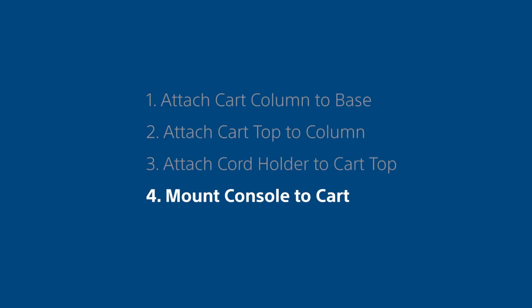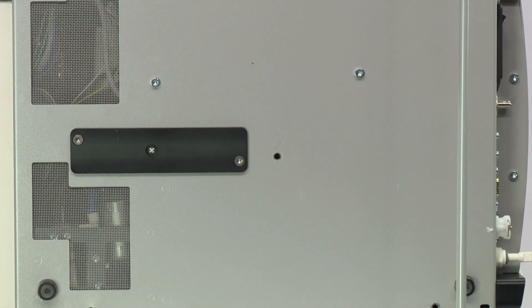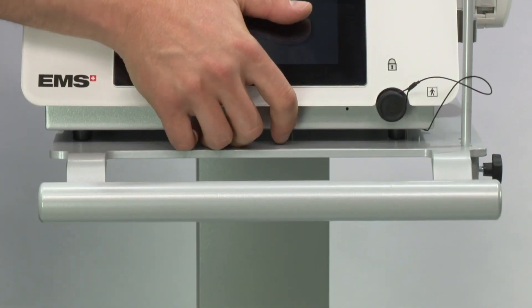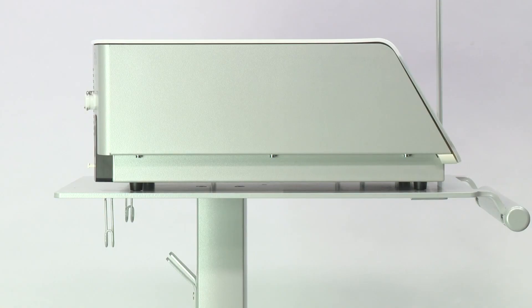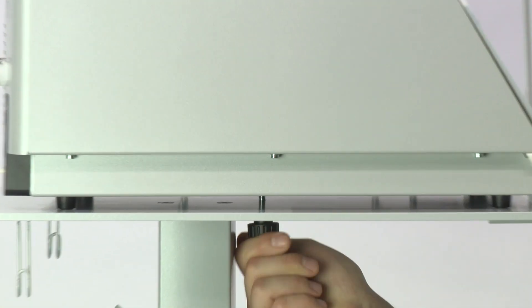Step 4: Mount the console to the cart. Place the Trilogy console on the cart, aligning the hole on the bottom of the console with the hole on the cart top. Attach the Trilogy console to the cart using the thumb screw provided.